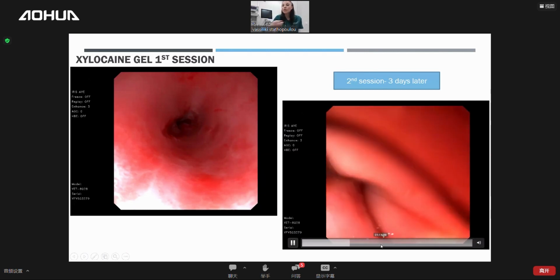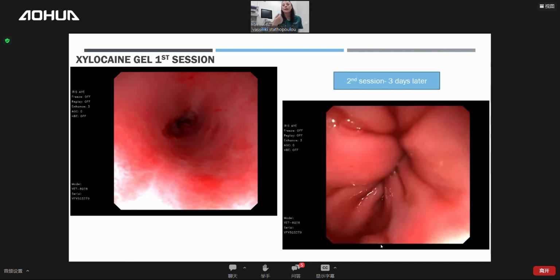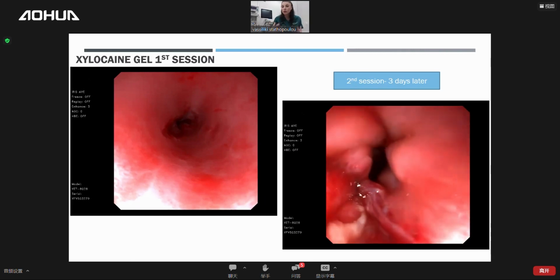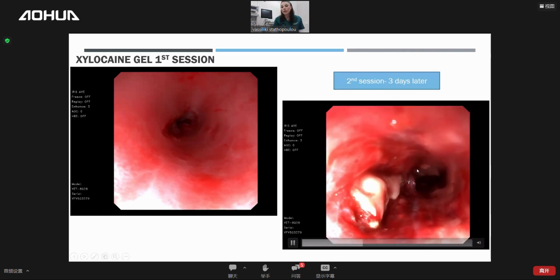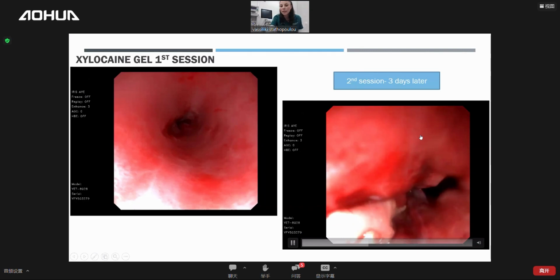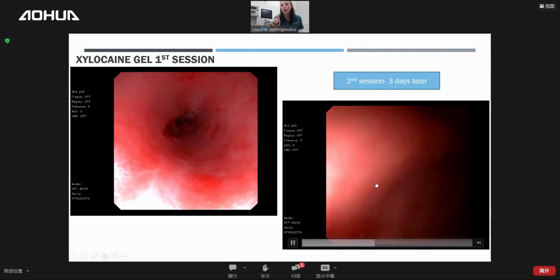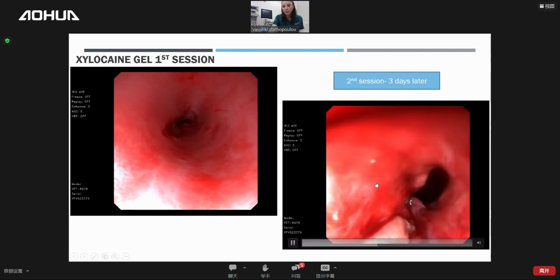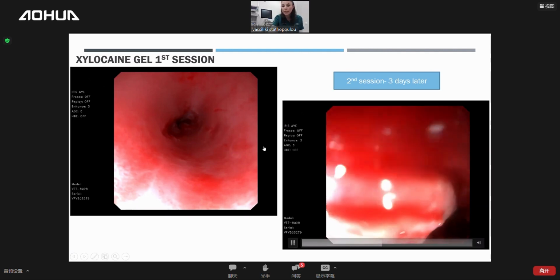And now what I'm doing, this is why you see this blurred picture, is that I'm taking my scope in and out, in order to keep the length of the hole that we have caused. We have caused that, okay? But this is going to heal. We don't care. You can see the damage. If you don't cause that, then you will never open the stricture. This is the kind of tearing that we need.